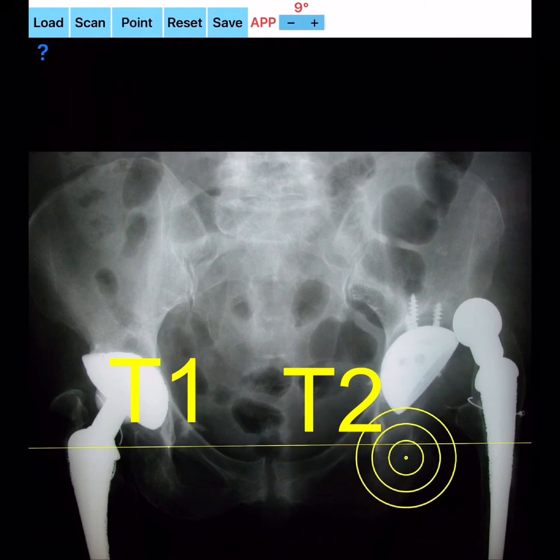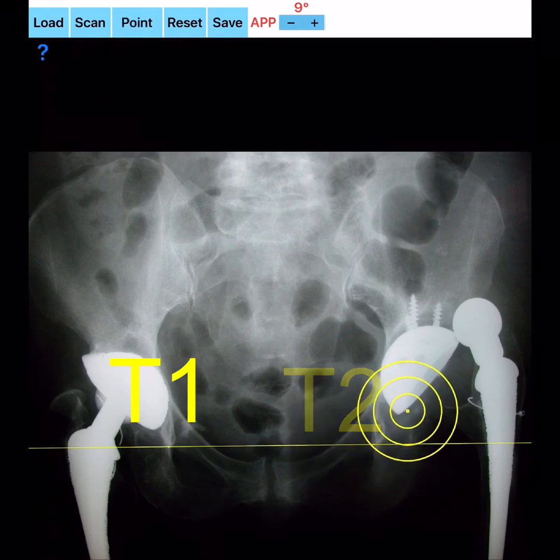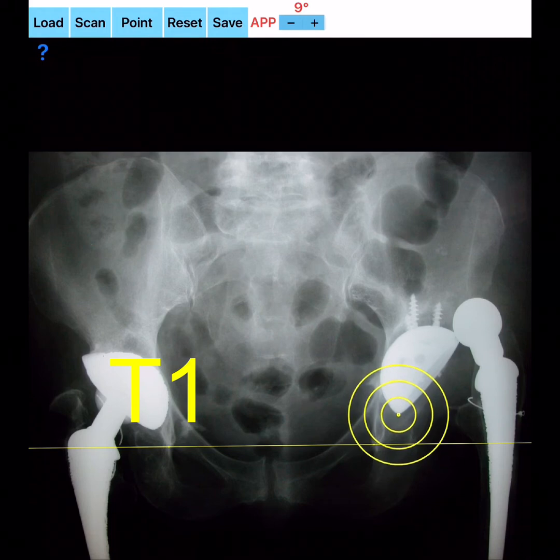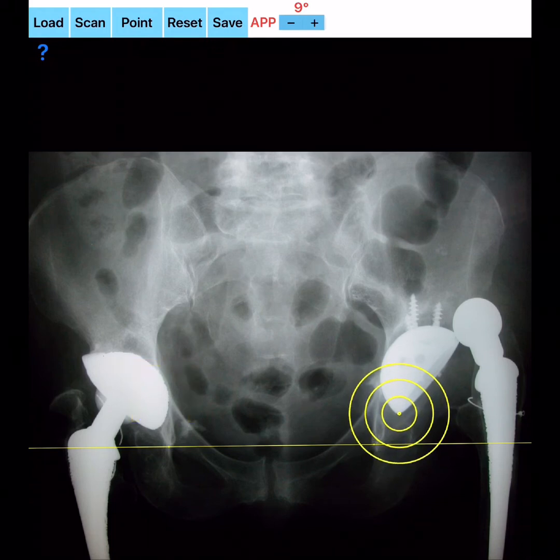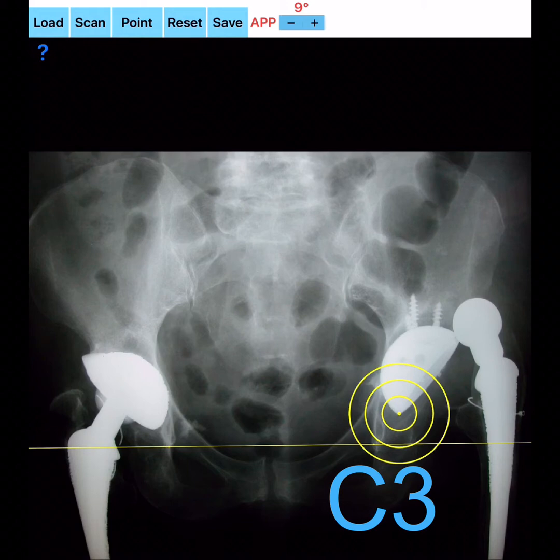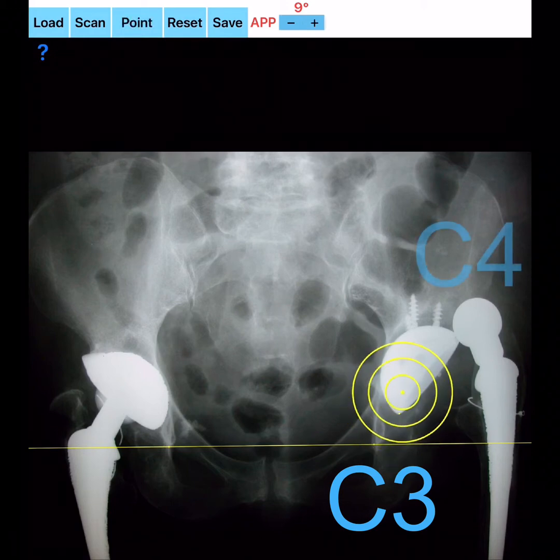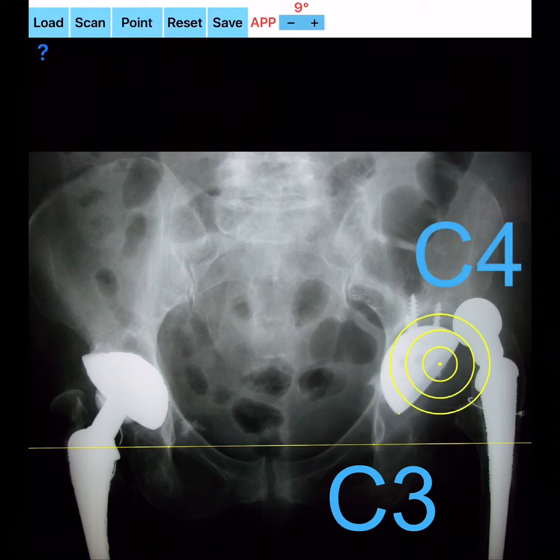By pressing the point button aiming at the most medial part of the acetabular component, C3 point is marked. By repeating the same procedure at the most lateral part of the cup, point C4 is marked, and a C3–C4 line in light blue is drawn.